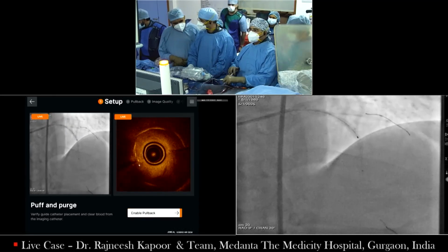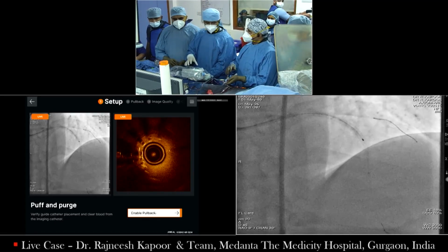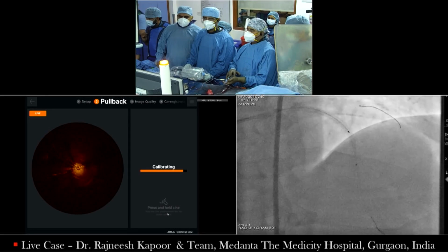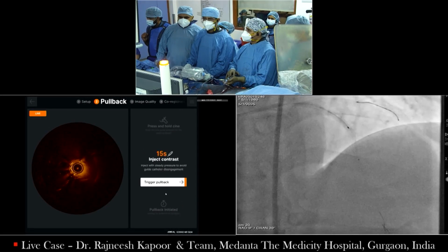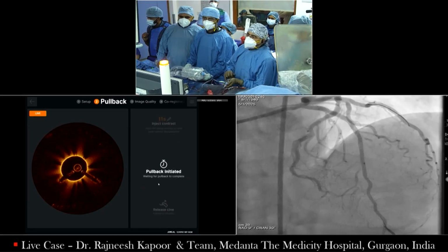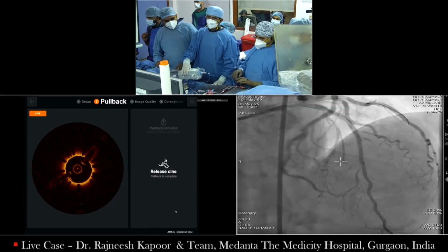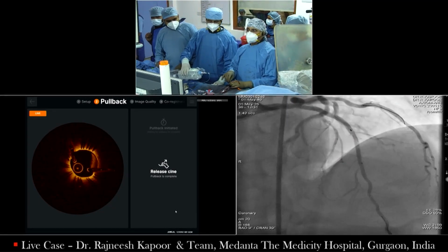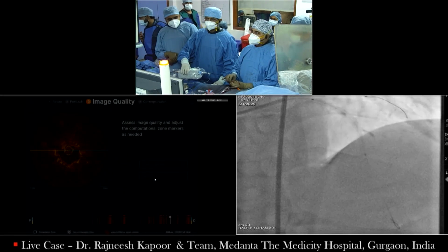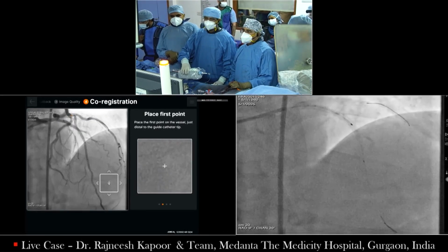I think both Rajneesh and Dr. Praveen Chandra are key opinion leaders. They know obviously all the steps of PCI. On the screen, you might see 5-second inflations, please. That doesn't mean that they are not following up with the optimization with the NC balloon and repeat imaging, and if need be, longer inflations as well. For the audience, just want to make sure that you don't take home that I can do 5-second inflations. So the message is not short inflations. This is for the sake of time in the live case, but we do wait for 10 seconds or so with any inflation.